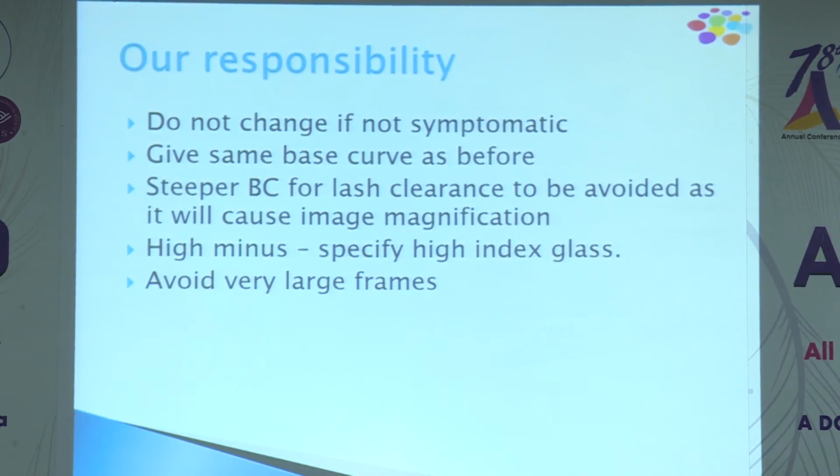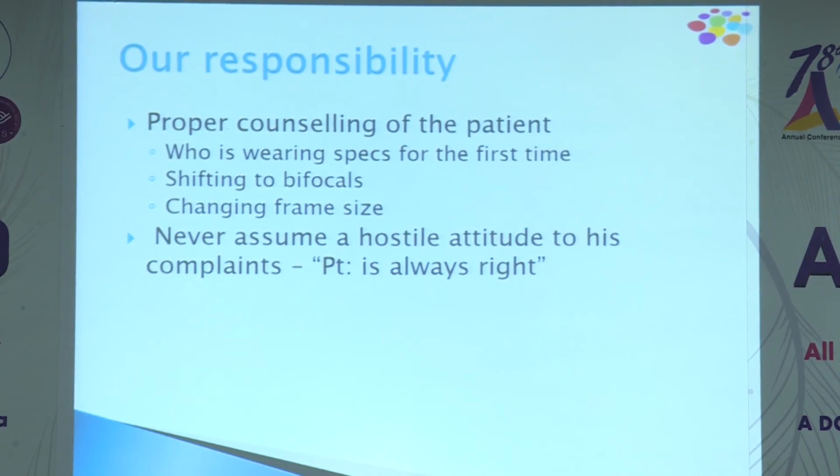And in high minus, specify to the patient that you have to go and buy high index lenses. Otherwise, he is going to come back. Avoid very large frames also. So proper counseling is a very important thing. Most of the time we just prescribe it. For progressive lenses, you have to explain before the patient purchases the glasses that these are the problems he is going to face. Then you can avoid a lot of complaints.